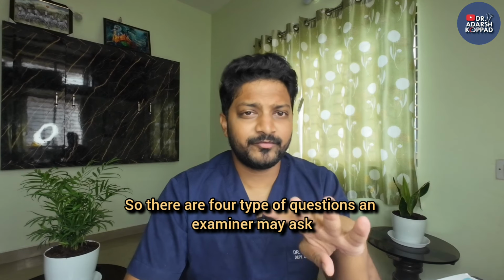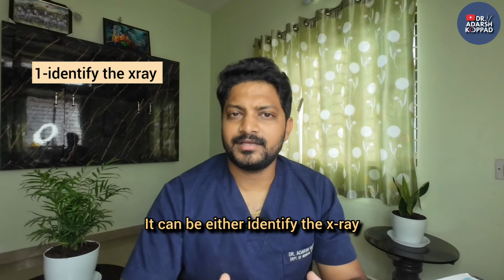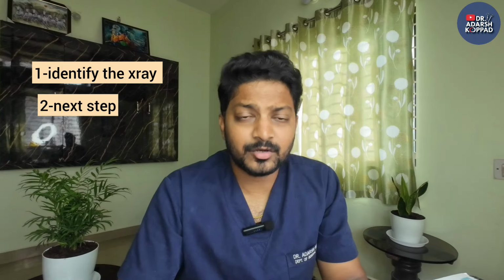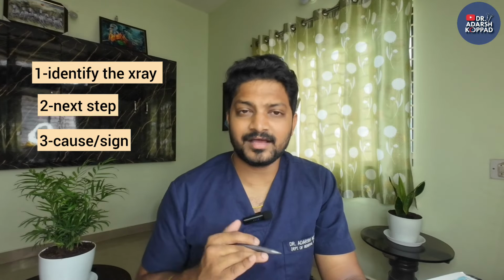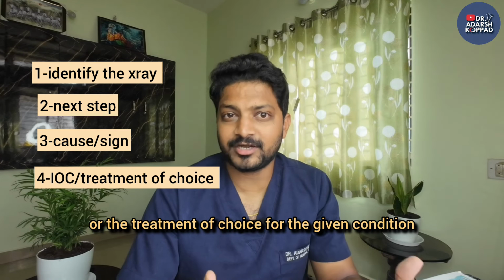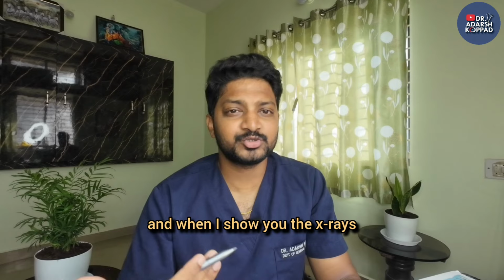So there are 4 types of questions an examiner may ask when it comes to an X-ray. It can be either identify the X-ray. The second type would be he'll give you an X-ray and ask you the next step in management. Or the third type of question would be he can ask you either the cause or highlight a particular finding in the X-ray and ask you to name it. Or the fourth type would be the investigation of choice or the treatment of choice for the given condition. And I'll discuss all these types of questions as and when I show you the X-rays.